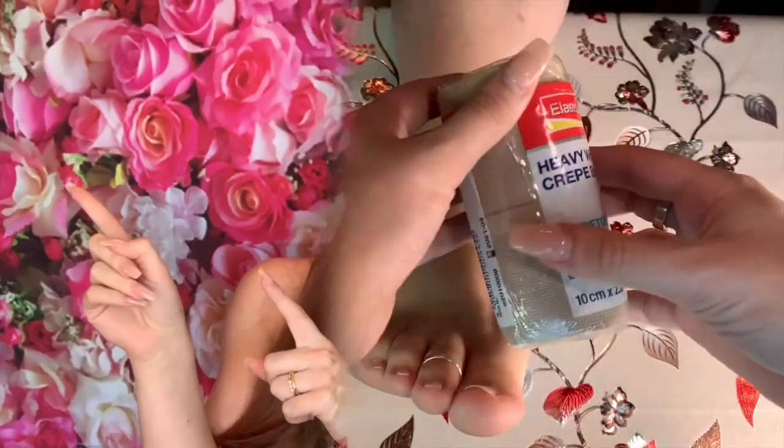Today we're going to use a heavyweight crepe bandage in an adult size — 10 centimeters by 2.3 meters — along with some cloth tape. So without further ado, let's get learning with Liv.